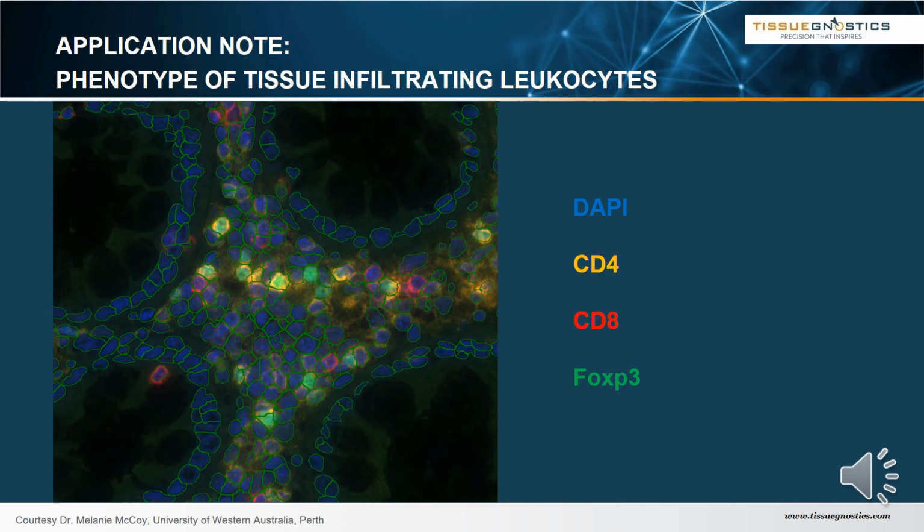Using the nuclear marker, here DAPI, as a master channel, we see what the software recognizes as individual nuclei, indicated by the green contours. And then, for each individual cell, we measure how much yellow, how much red, and how much green is present. And of course, this measurement can be extended to any number of cells and any number of channels per cell.